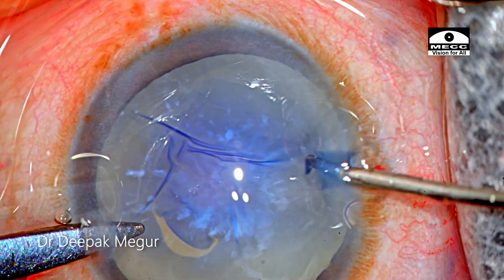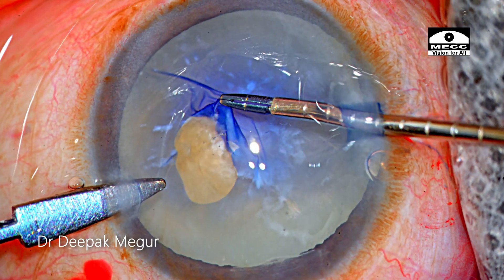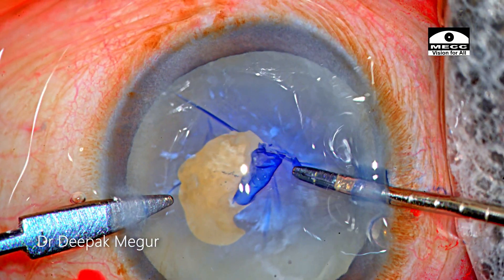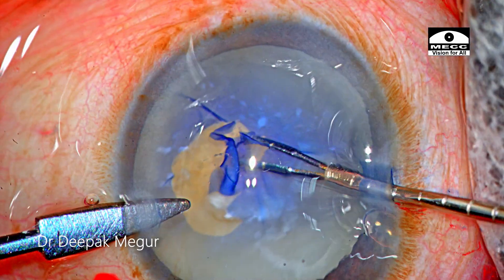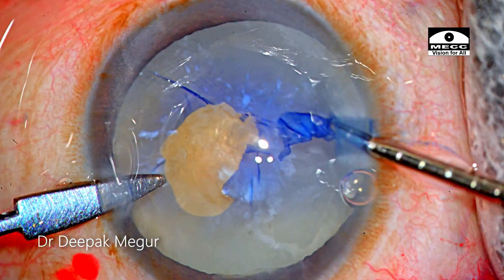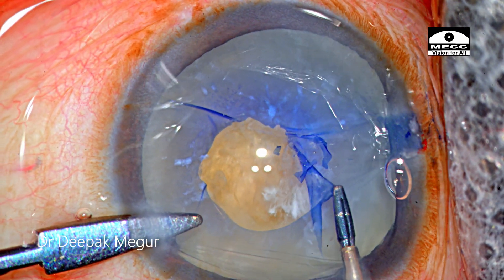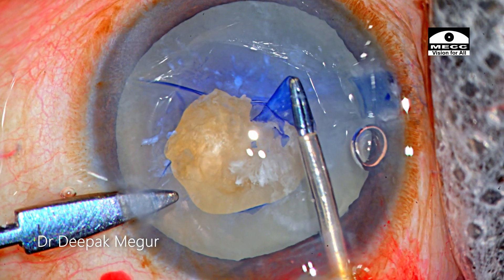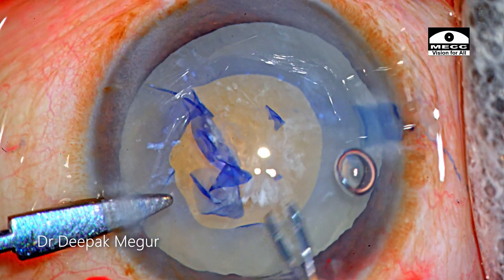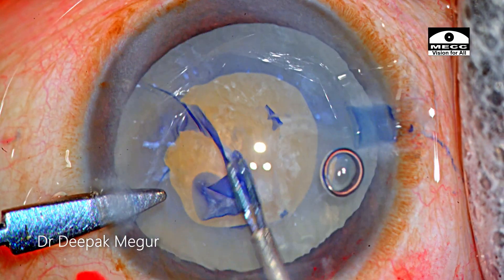I quickly switch to my forceps, and luckily when I try to peel it, it just comes out. Again I hit an area of resistance and I don't persist much here. So I end up having a very small rhexis with a couple of ragged edges. Now I change the angle of attack and try to go in from the other end. As soon as I get around the calcific plaque, it's easier to tear the normal capsule and complete the rhexis. Again during completion I hit this band here, but luckily it didn't cause much problem.